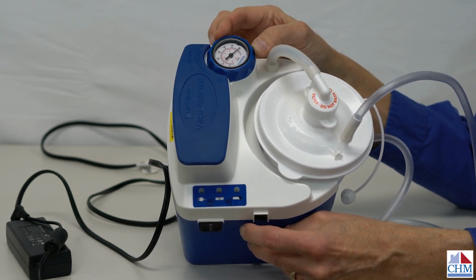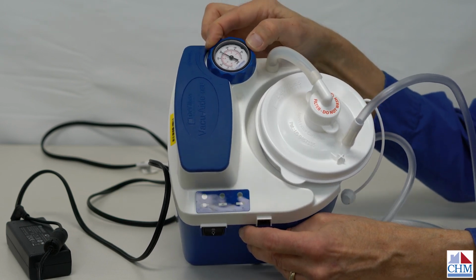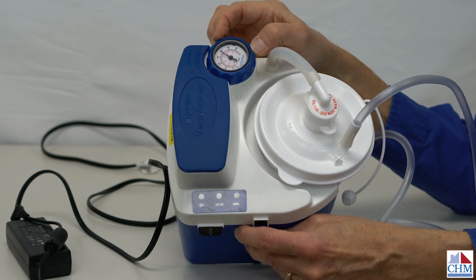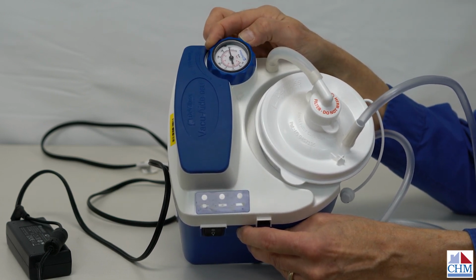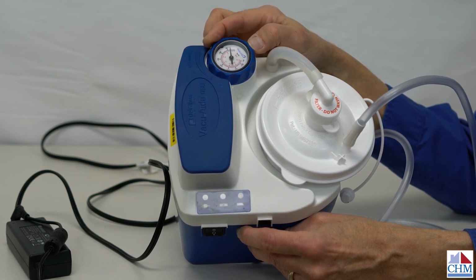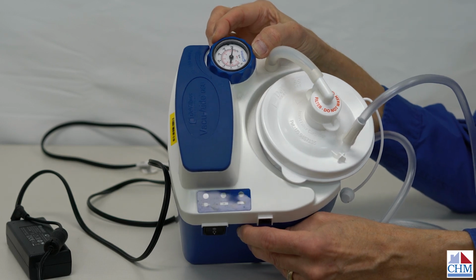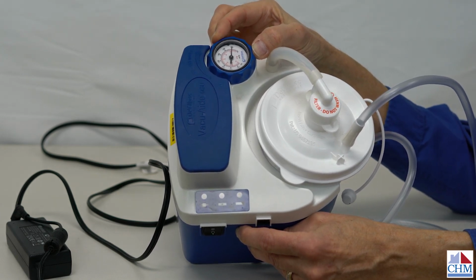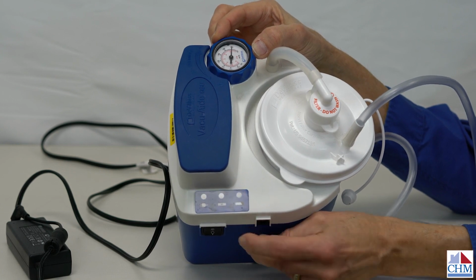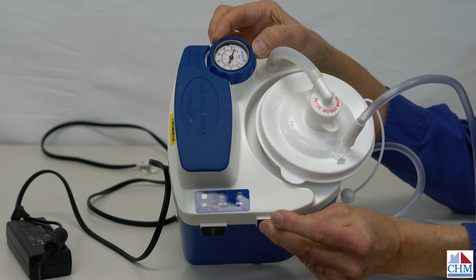Now if I turn the knob, I can make the suction pressure go up, and notice that I'm turning the entire gauge when I do this. I'm going to go back down to about that 150 millimeter of mercury mark, which is where I want to have it set. I can't quite see the numbers there, but shoot for 150 millimeters of mercury. So that's your suction pressure, and I'm doing that by occluding the end of the tubing.